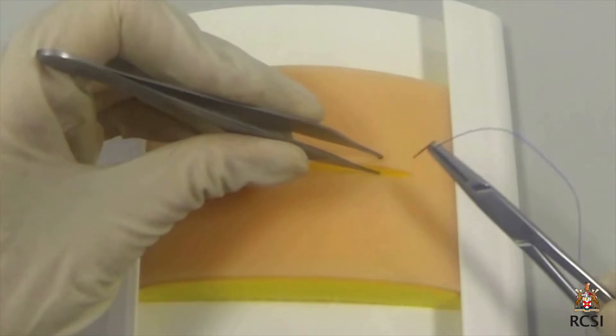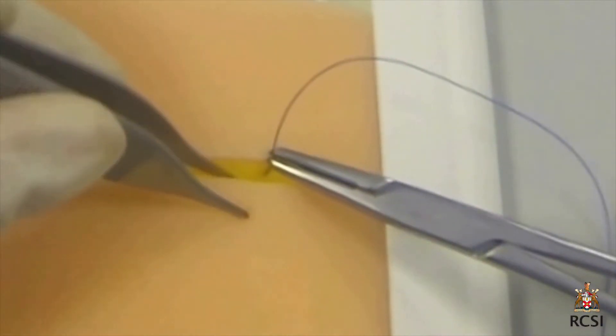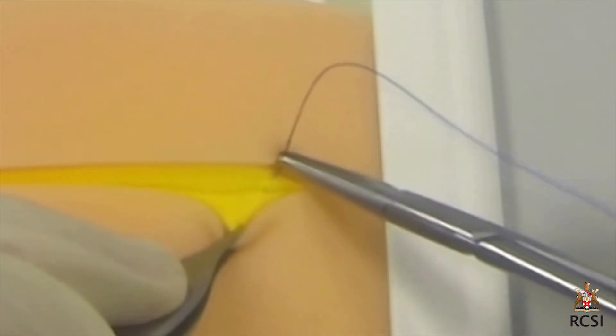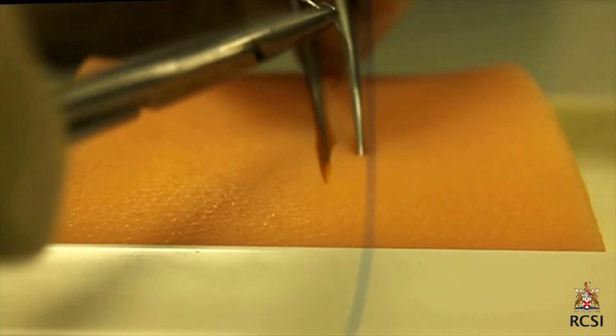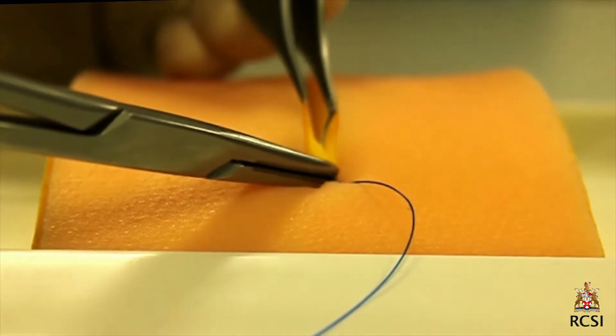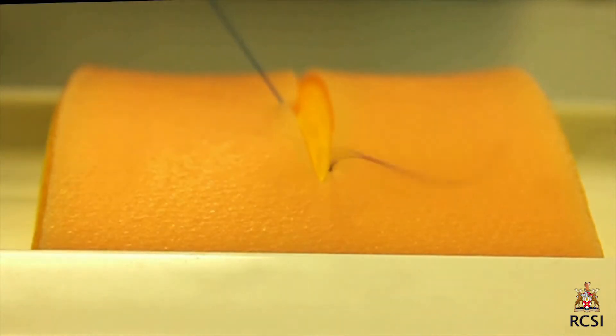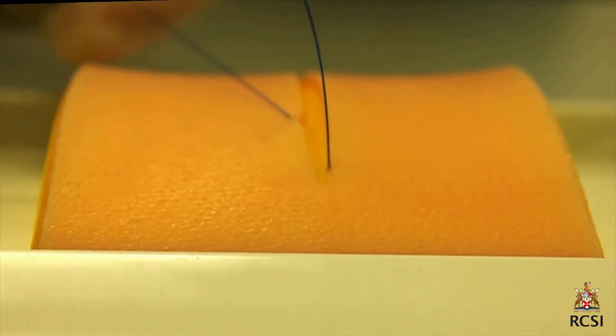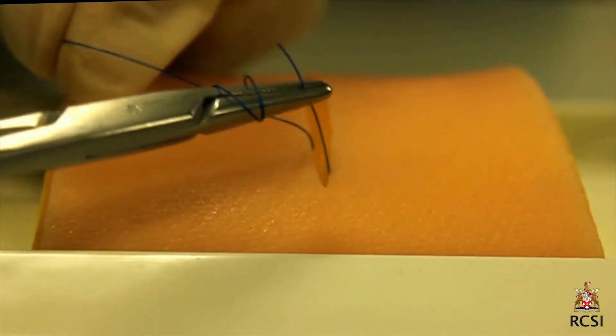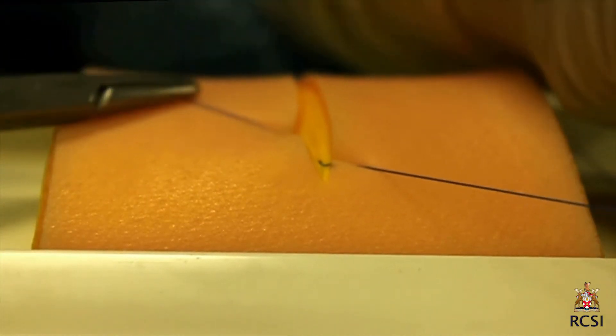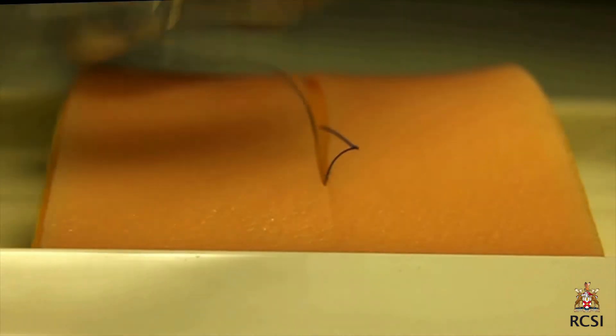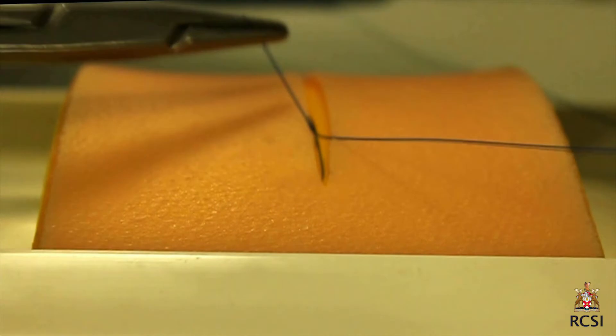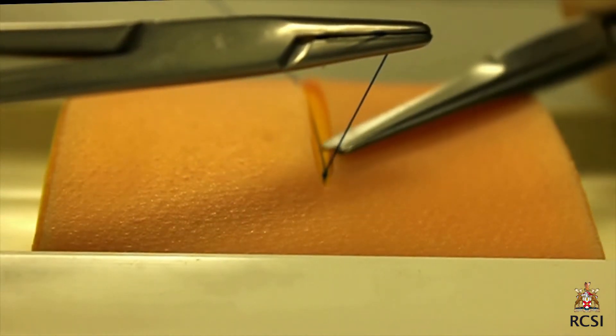The closure method is commenced with one deep suture in the subcutaneous tissue near one end of the wound. The forceps helps to see into the wound to take the first bite. The knot is closed with the surgeon's knot and this is secured with the reef knot. The short end is cut just below the skin edge.